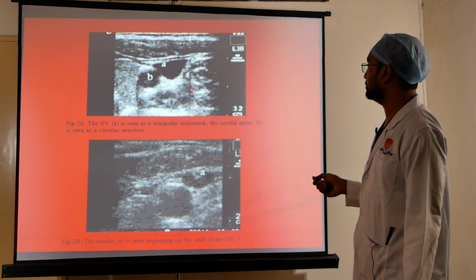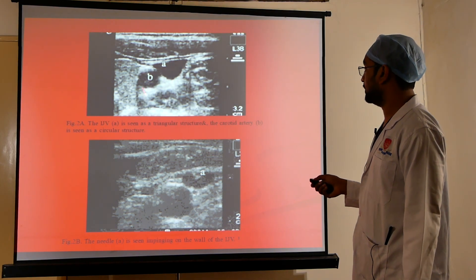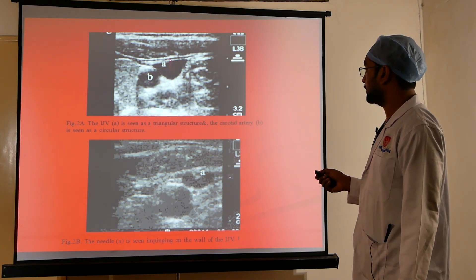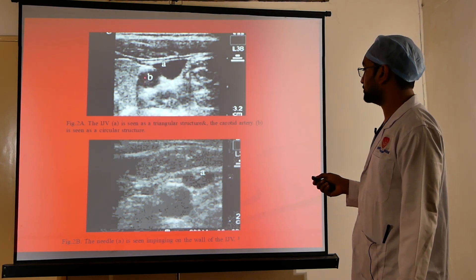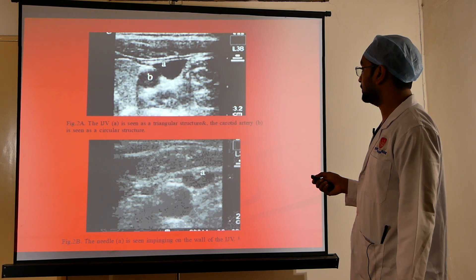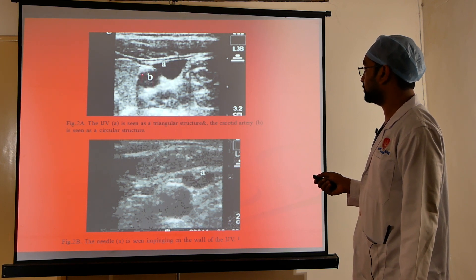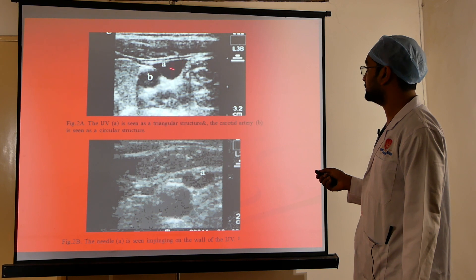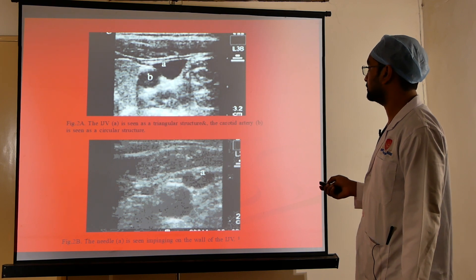An ultrasound view of the carotid artery and internal jugular vein shows the carotid artery as a pulsatile structure, with the internal jugular vein just lateral to it.